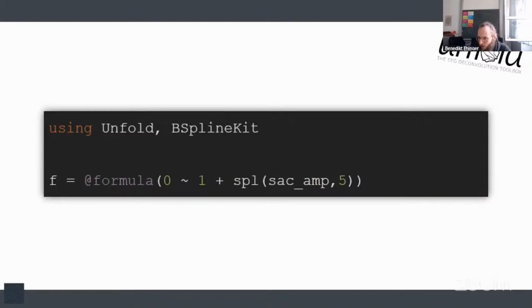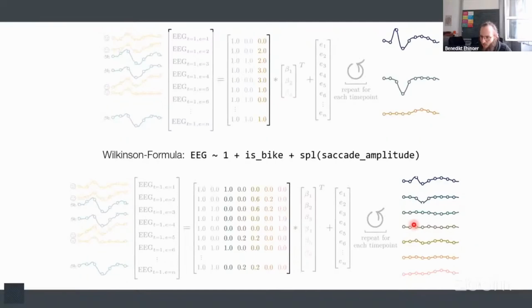Okay, so there's a question. Does this mean a column in the matrix corresponds to a spline? I guess this is a question about this slide here. I think this is just a terminology question, what you call a spline, whether you call the whole basis set a spline, which I think is typically done, or whether you call one of these things one of the spline functions.